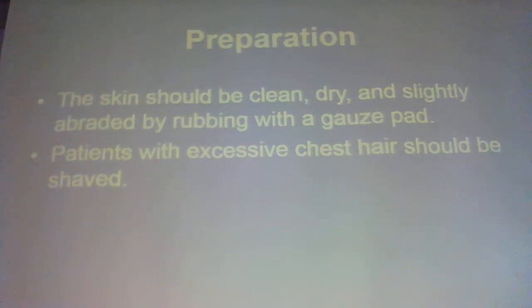It's in a tape roll. Yeah, it's like sandpaper, and you can buy electrodes with that on the back. Abrader pads is all it is. It's kind of rough. 220 grit sandpaper, made by 3M. It comes on a roll just like tape that you make Christmas presents out of. It makes a big difference. Sure it does. That was just funny. It does seem like a Des Moines fire thing. It is sandpaper, and here is the hardware store.